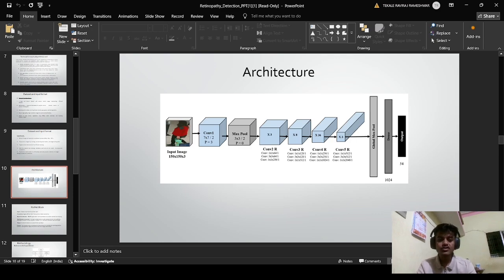It allows the model to learn only the difference, or the residual, between the inputs and the desired output. This helps us avoid the vanishing gradient problem and makes it easier to train very deep networks. In the output, we take a mix of the original and the learned features and pass it to the next ResNet block. The block design makes ResNet highly effective for image classification, especially when we deal with complex medical images. It helps the model learn deep features without performance degradation.